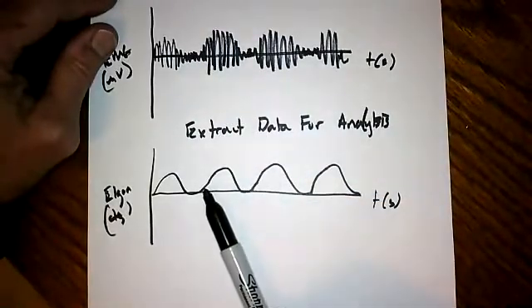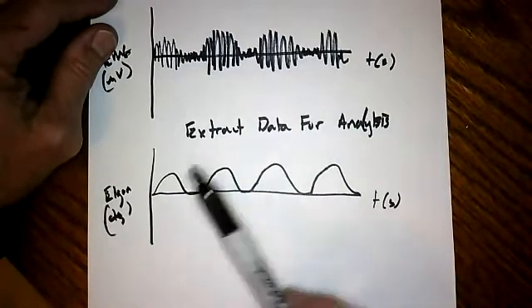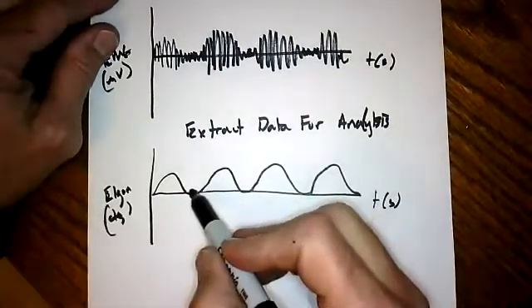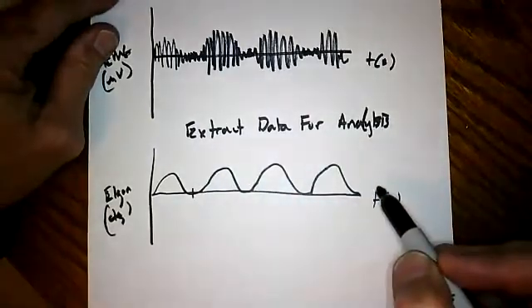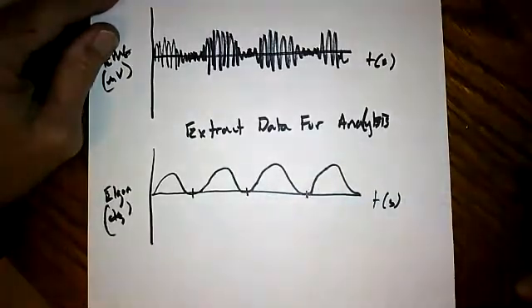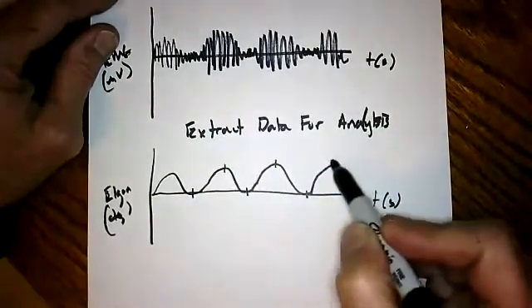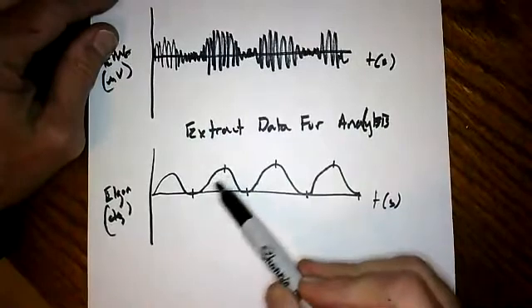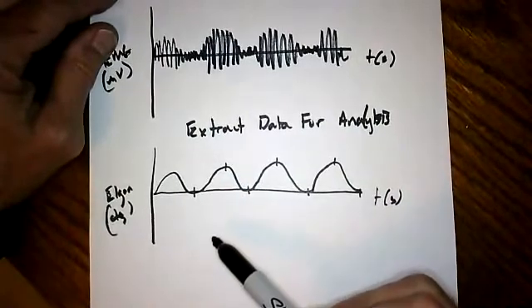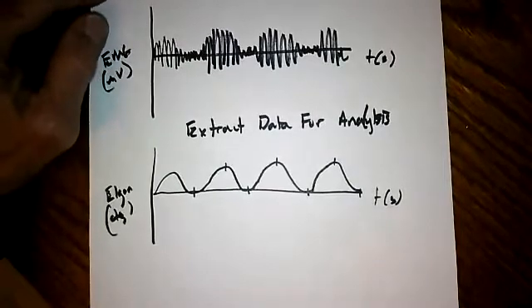So we want to analyze our EMG data. First thing we need to do is set a criteria for when to extract the data for analysis, when to end. And maybe you want to extract based upon a minimum angle. And maybe it's minimum to minimum, okay? And maybe you do multiple cycles. Or maybe it's max to max. Or maybe you calculate velocity off of this and then acceleration, and then you take a max or min of that. Whatever the criteria are, you need to specify them.